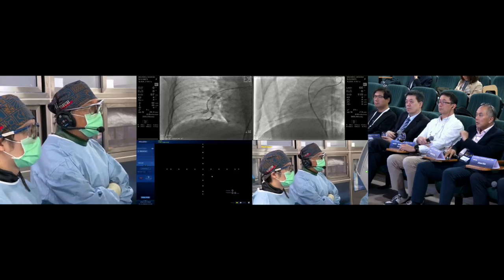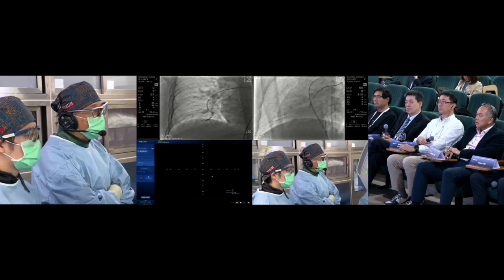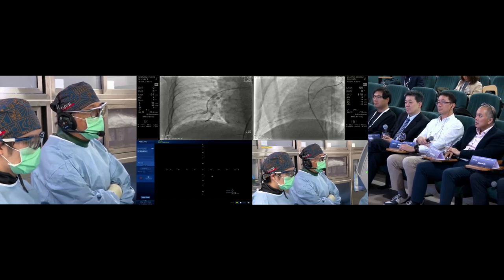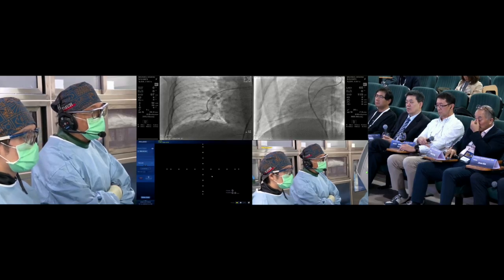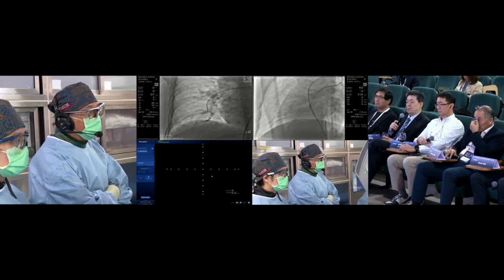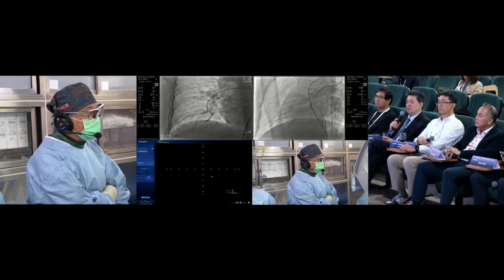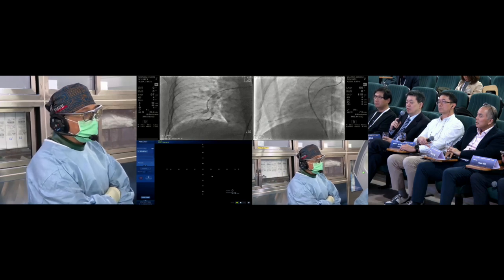There's no big lesion around the proximal PA part. I think the lower PA pressure right now is probably because we have the catheter and the balloon in the catheter, so it's not very accurate. Maybe after we withdraw the guide wire and balloon, we can measure the pressure again. Yes.